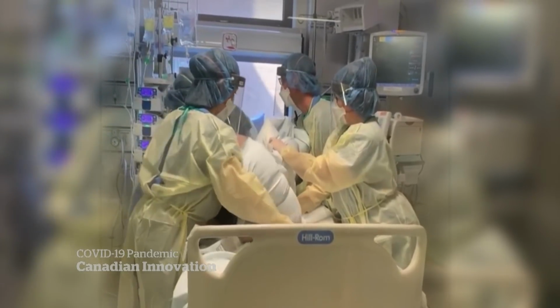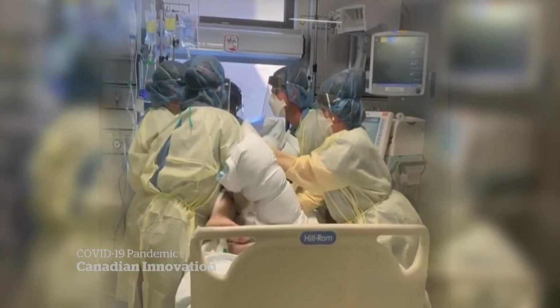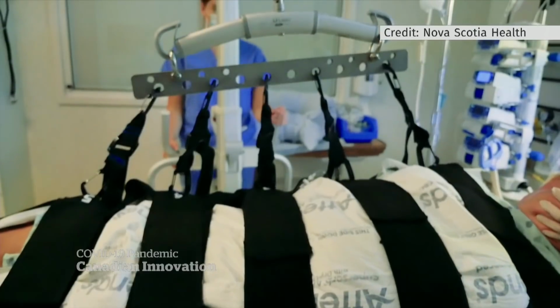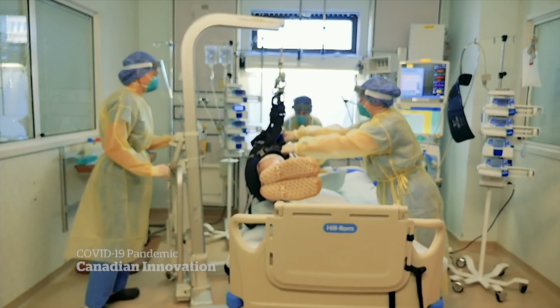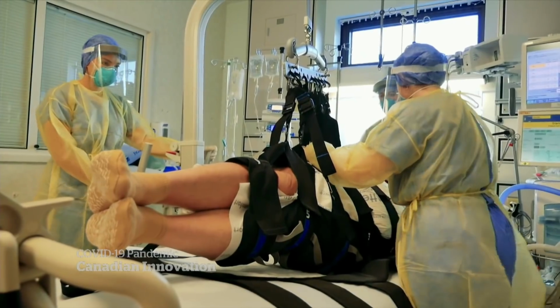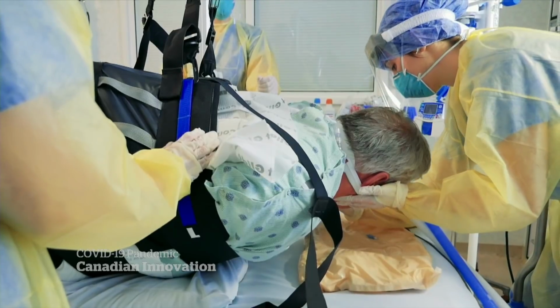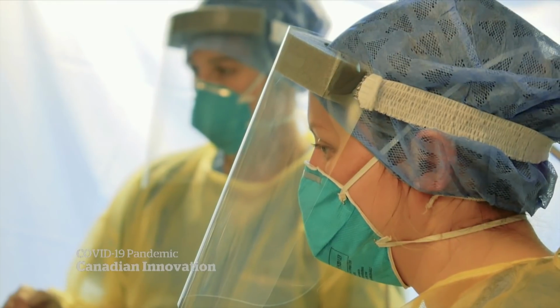Remember the way nurses prone a patient now, the almost hour it takes to do it? Well, this new device, already on the bed when the patient arrives, hooks up to a hospital mechanical lift, which up until now could only hoist a patient up and down. It requires a fraction of the staff, and get this, only about 8 minutes to gently roll the patient over to the prone position or back again, and no nurses lifting.